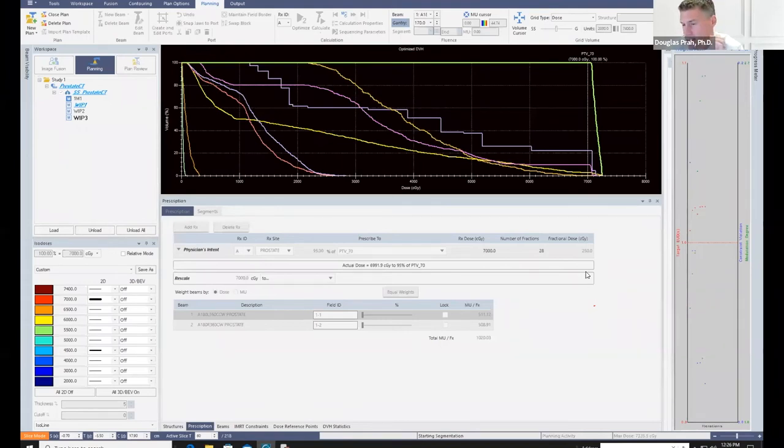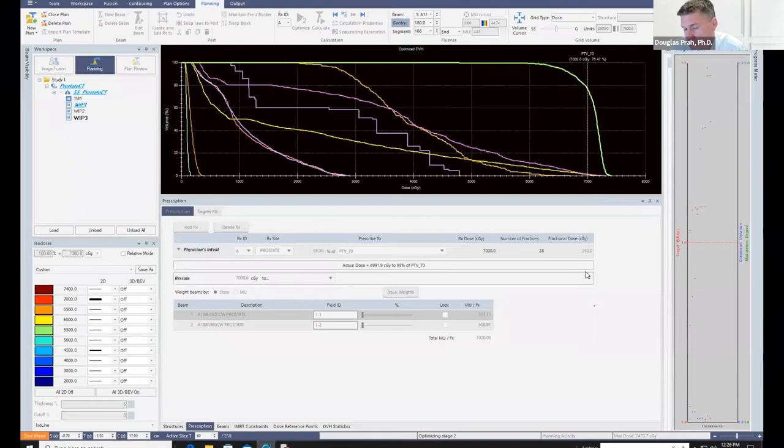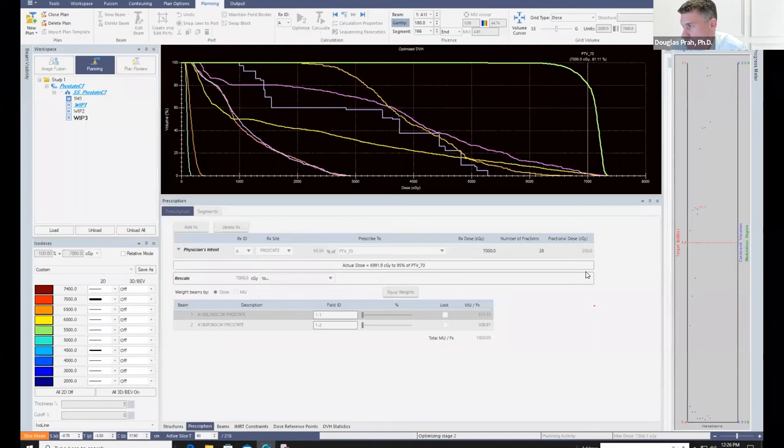So I find that our model does pretty well up to about a modulation factor of between like 8 and 10. And then when I do IMRT QAs, my pass rates start to go down a little bit. So it's something to keep in mind if you're trying to get plans to pass QA, that sometimes it can be overmodulated, and maybe when you initially evaluated your model, you didn't put that much emphasis on MLC leakage outside of the field. So if you had any errors during modeling, they get amplified as modulation degree increases. So keep an eye on that. If it goes up too high and you can't get your QA to pass for some reason, it could be that you just overmodulated the plan.